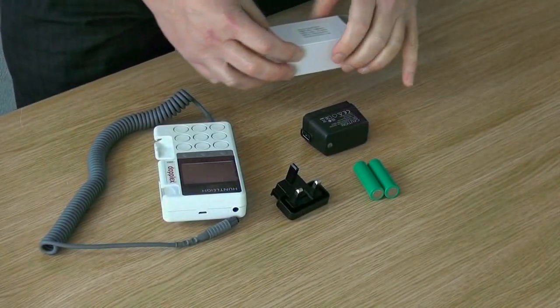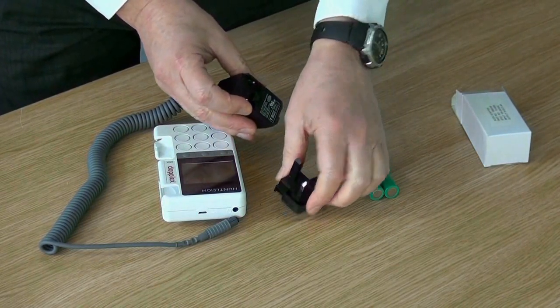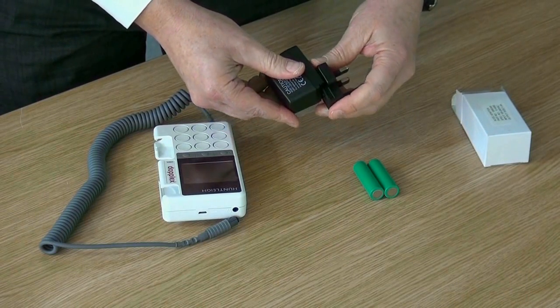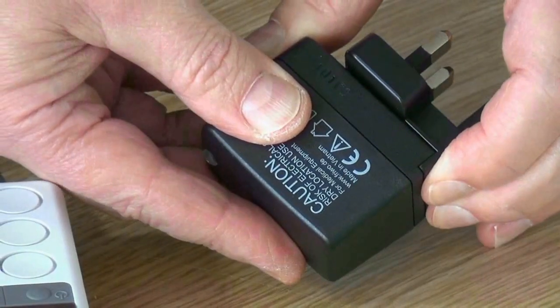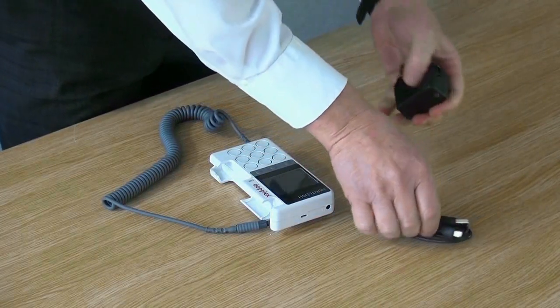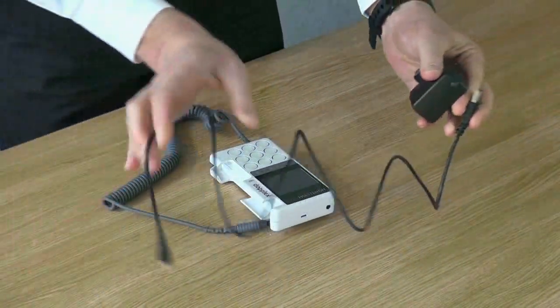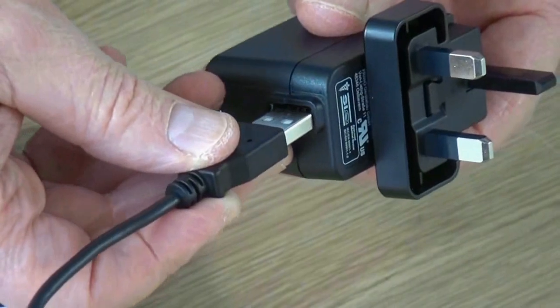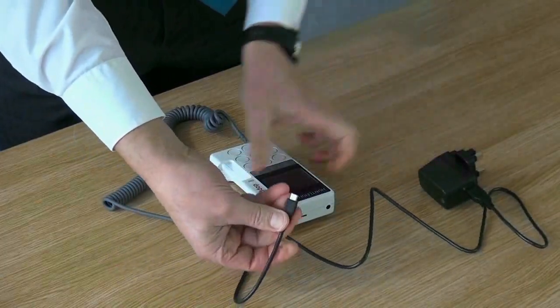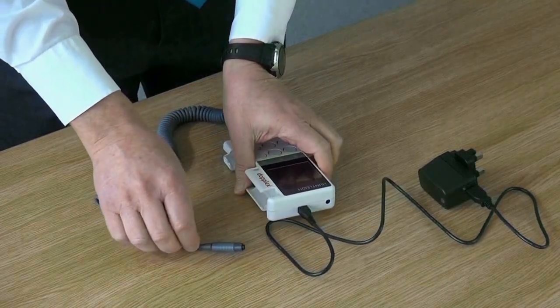Connect the charger to its appropriate adapter and slide it into place until it is securely connected. Take the USB cable and connect it to the charger using the standard USB port. Take the opposite end of the cable and connect this to the micro USB at the top of the Doppler unit.